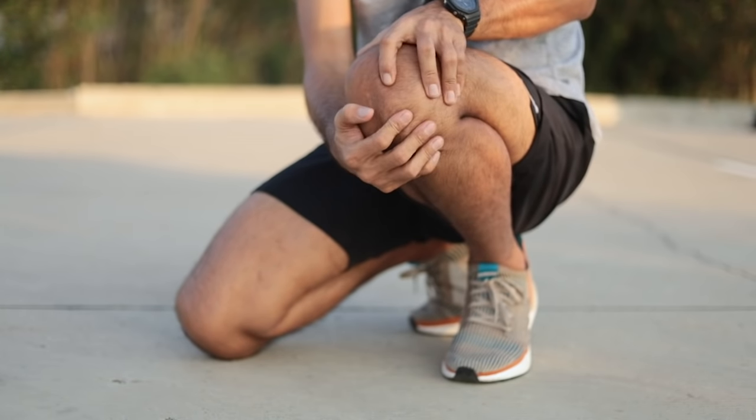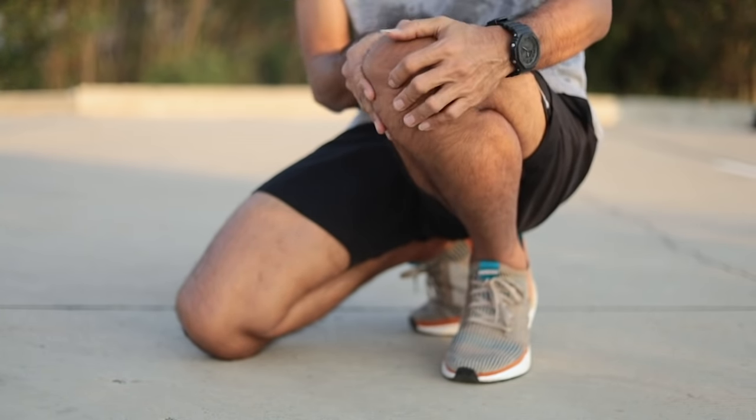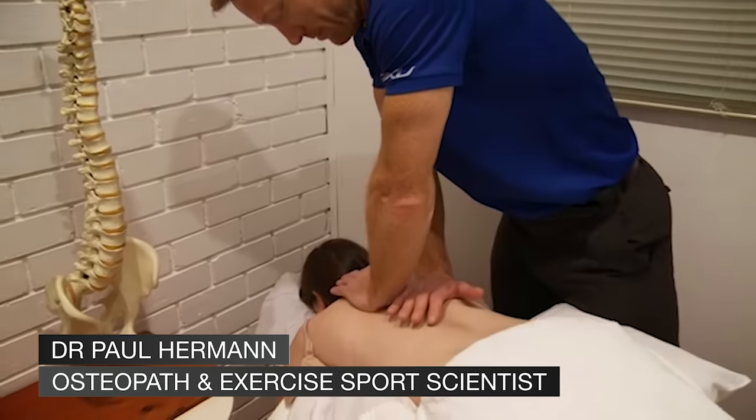Knee pain is common, especially if you're an active person. I'm Dr Paul Herman. I see knee problems every day.